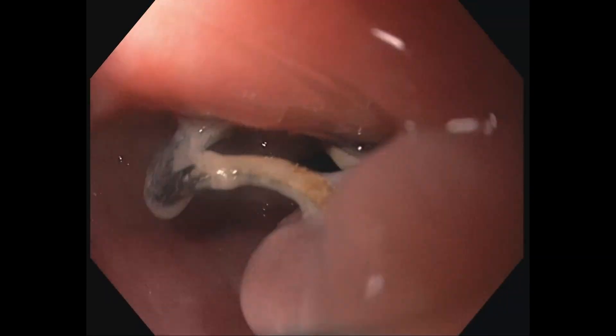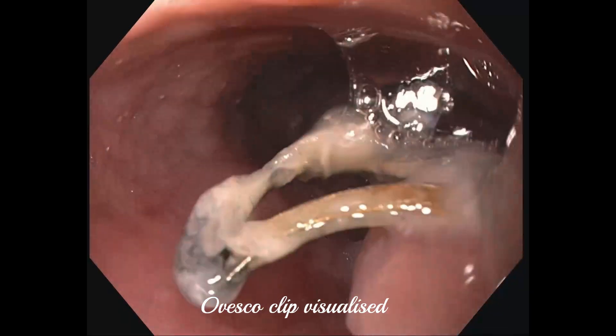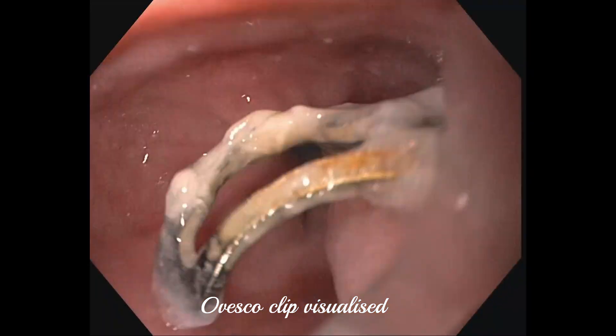In June 2023, endoscopy was done for persistent symptoms which showed esophageal candidiasis. A bronchoesophageal fistula was noted and an OVESCO clip was placed.